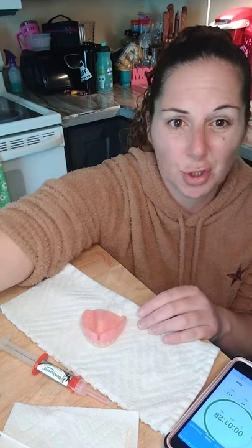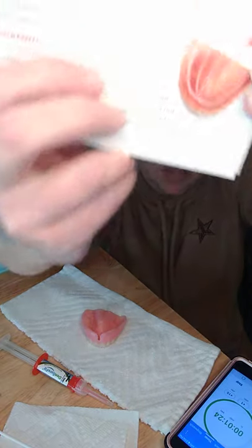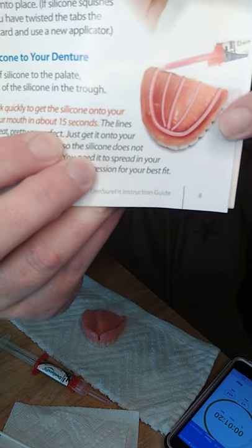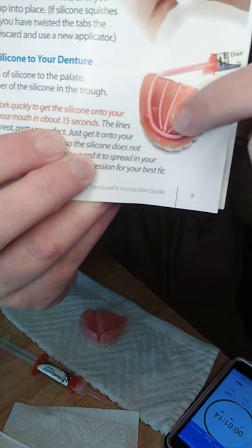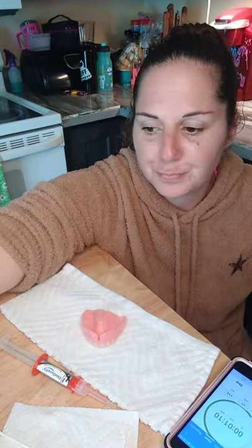I'm going to show you guys a picture in case you can't see it from this far, because my son is not here to show you guys. This is how you want to lay it out. You want to do one down the middle of your palate, on the left side and the right side of your palate, then fill the rest in your trough. And I'm going to show you guys that I'm going to do that.